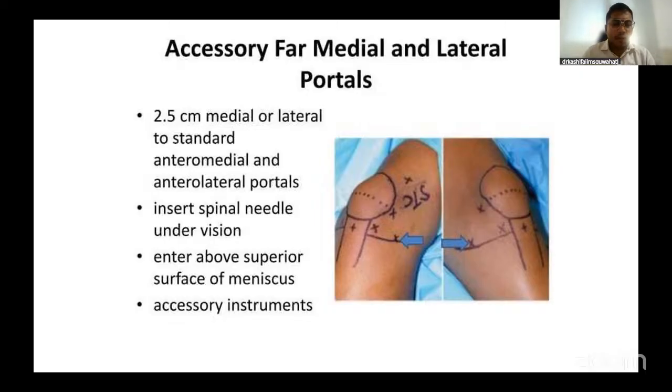But what is important is that you cause no further harm, so you need to clearly visualize the needle and then replace it with the knife when you are making the portal, so that the knife is completely under your control while you're getting that giving-way sensation.